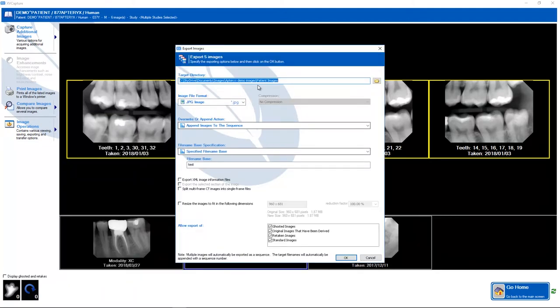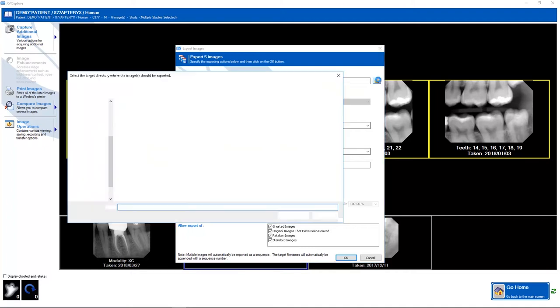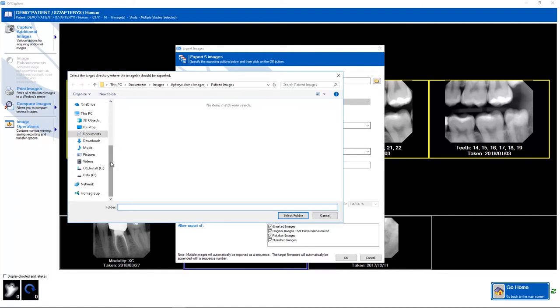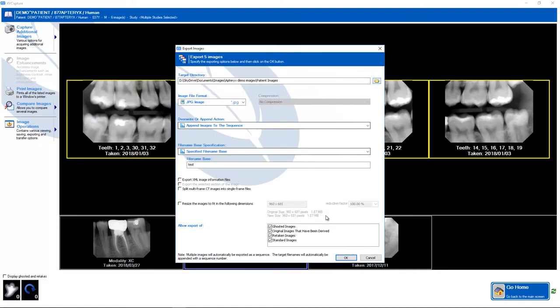Here I would choose my target directory. This is where the image or images would download to. If I have a default setup, it would automatically populate. Otherwise, I can click on the browser button that will automatically go to a Windows browser where I can navigate to where I would like to download that image or images.